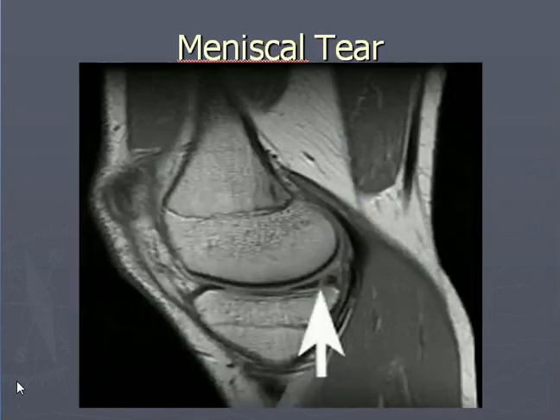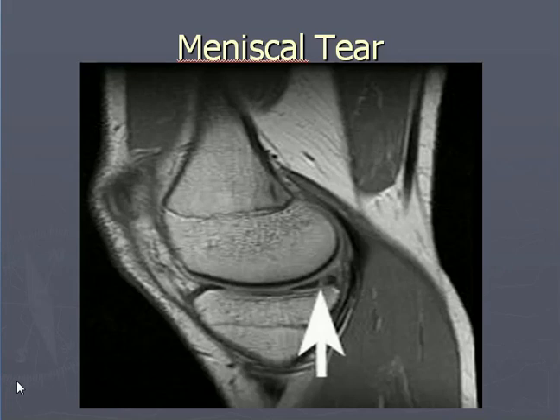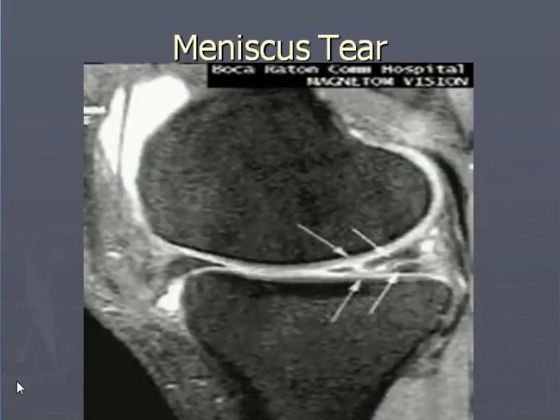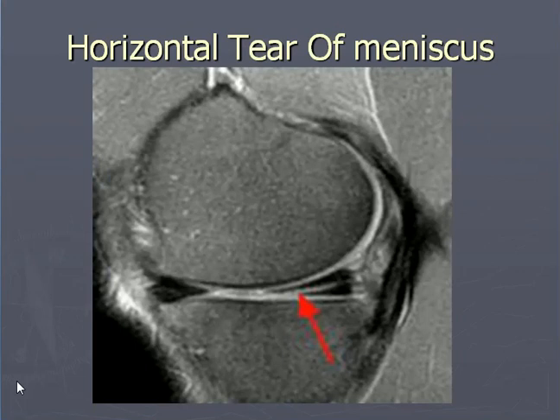Meniscal injuries — this is very interesting. You can see meniscal injuries without arthroscopy. This is non-invasive and you can see the meniscal injuries. The arrow shows the level of the meniscal tear. Another case of meniscal tear with multiple arrows indicating — this is the medial meniscus. Horizontal tear of the meniscus — again this is the medial meniscus.